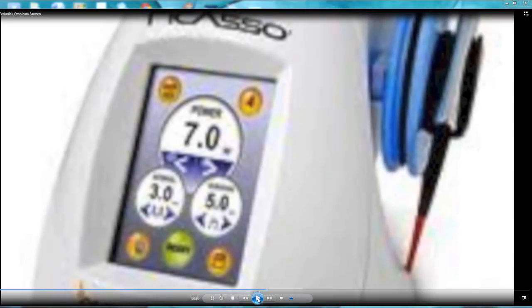Another thing I'm trying to use also is my soft tissue laser. Sometimes you see overgrowth of the tissue, and when I'm trying to scan or take the impressions, I want to make sure that my margins are clear and visible from the occlusal point. If I can see the margins, it will be easy for me to fabricate the restorations. If I won't be able to see it, I use more cords or probably use a soft tissue laser, as you see in this picture.